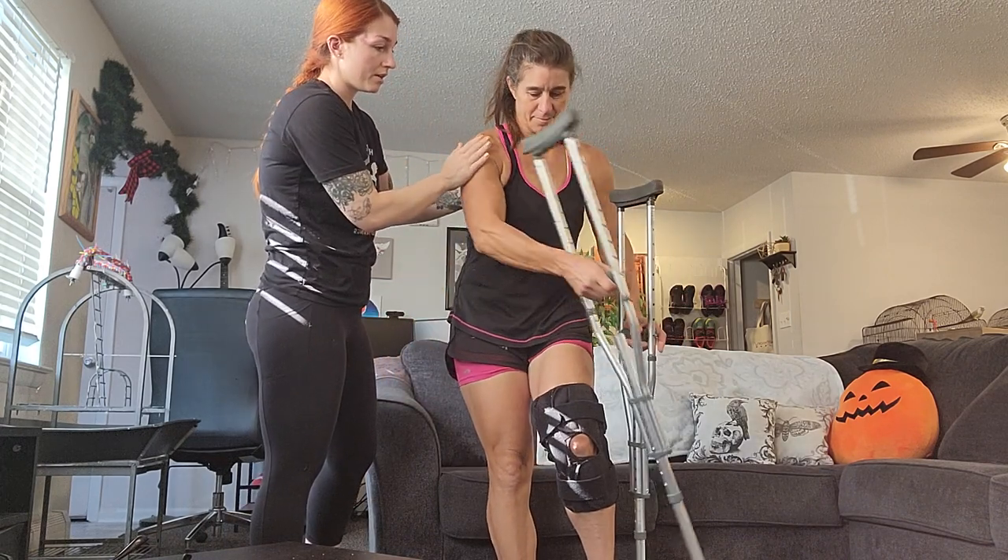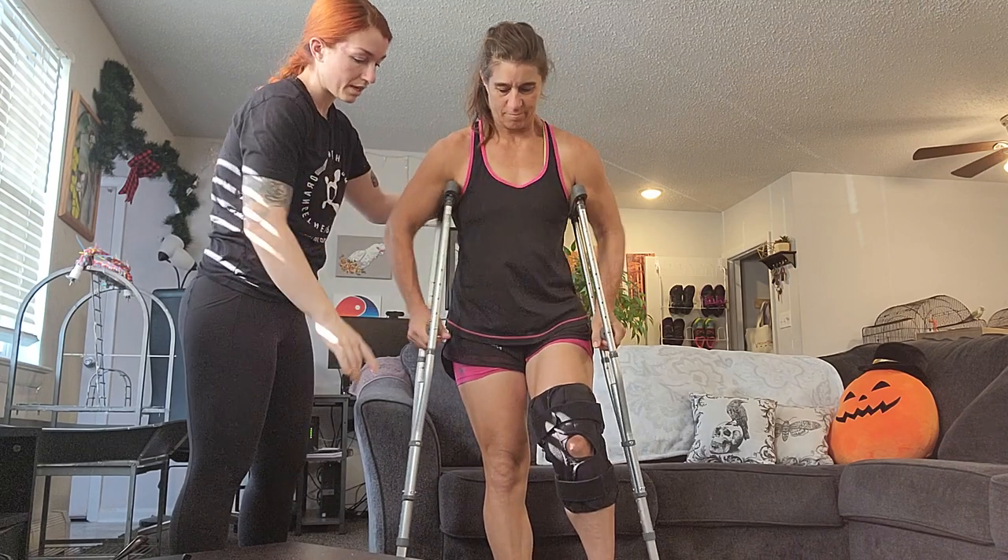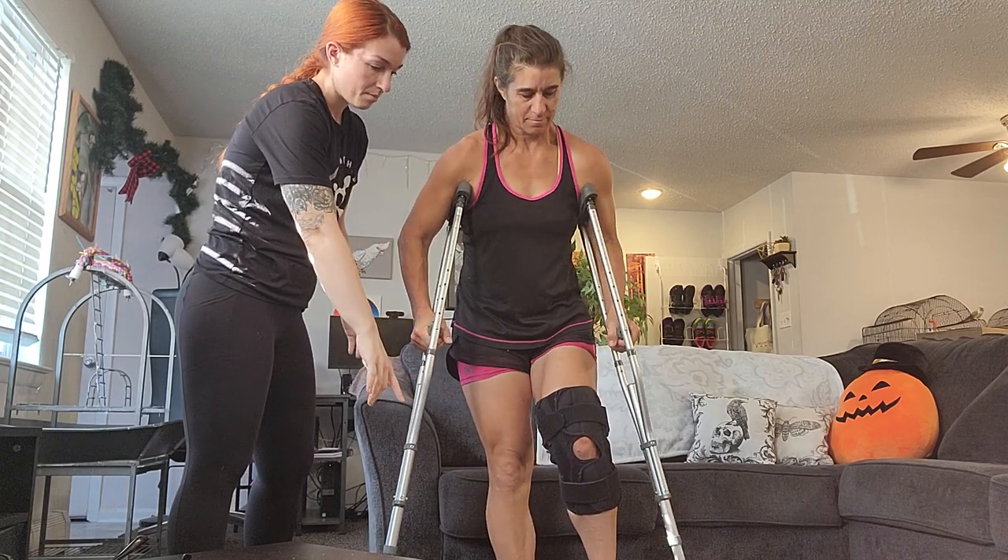So we're gonna go ahead and shift sides. Good. And you want those crutches out a little bit from your body. Perfect.